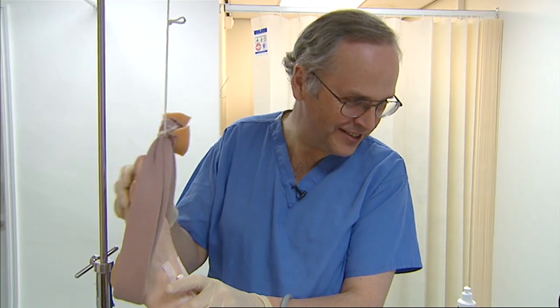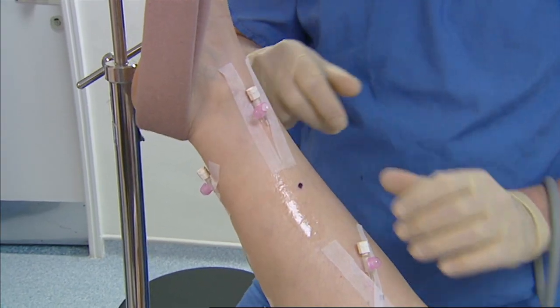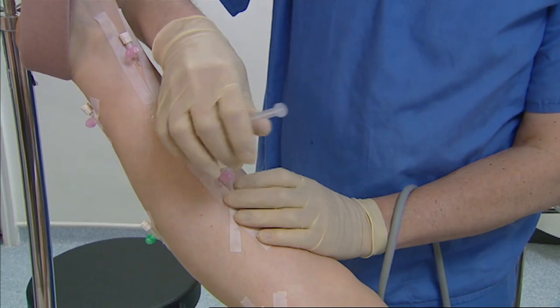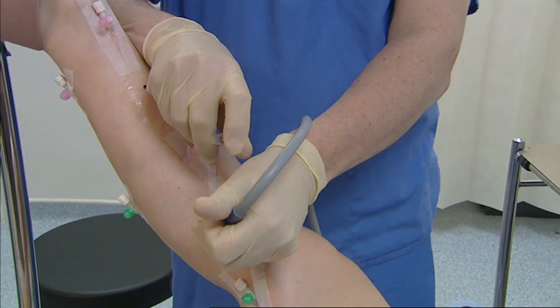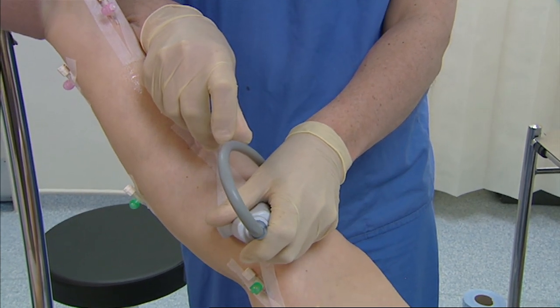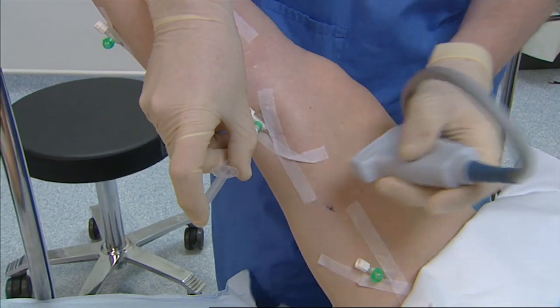We inject fairly small quantities, usually not more than two mils at each cannula at any one time, and we inject it rather slowly. Injecting it fast can be painful for the patient and cause excessive pressure in the veins. In some people it can cause thread veins to develop at the site of injection. So we carefully inject usually two mils into each cannula at each position. We would inject 1% fibrovane foam into the more superficial veins.